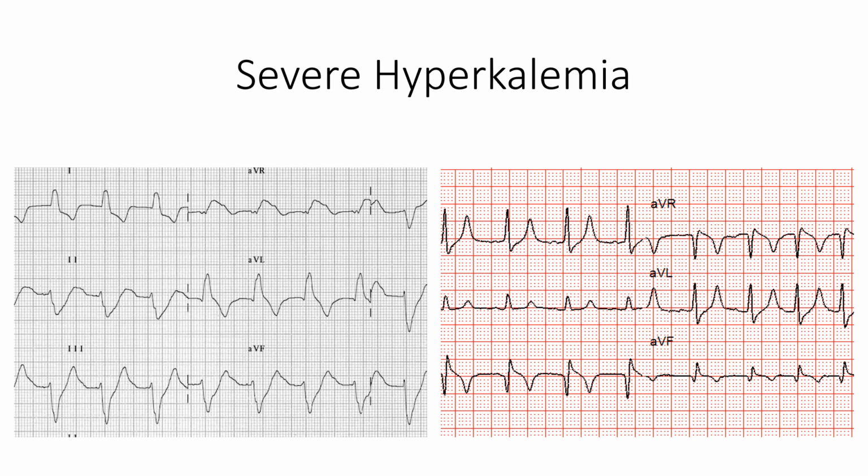So patients like renal failure patients, who often develop hyperkalemia, may not have ECG changes that occur until much later. So the ECG is not a wonderful diagnostic. Again, in the pre-hospital arena, it's one of our primary diagnostics to help catch it. But the very interesting part with severe hyperkalemia is the T waves start to go back down in size and the QRS widens out.